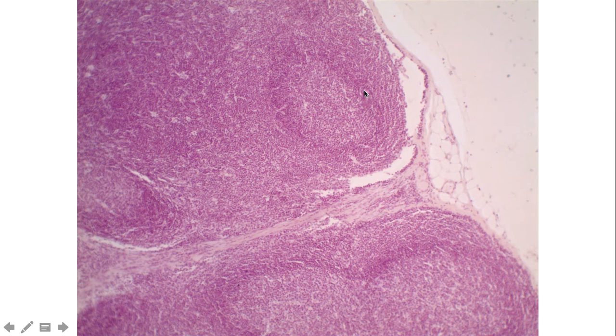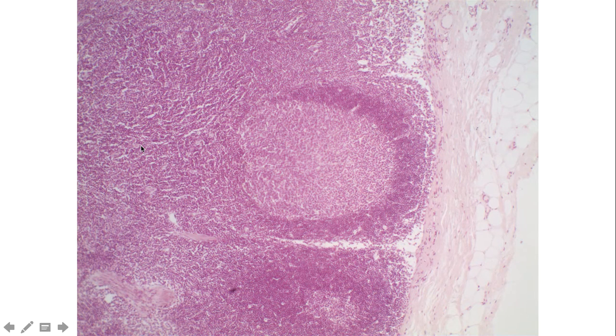And those cortical sinuses, as they continue to move towards the center or the medulla of the lymph node, then become sinuses in the medulla. And so we call those medullary sinuses.